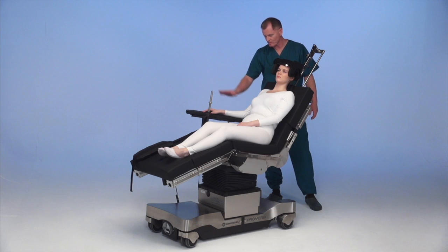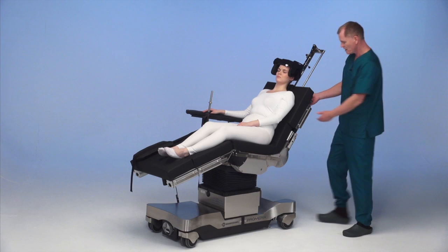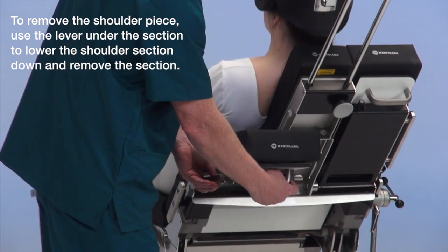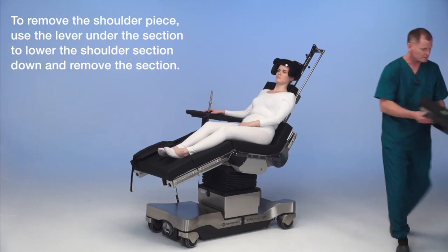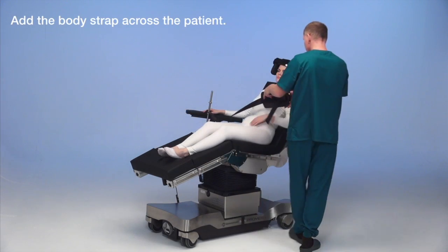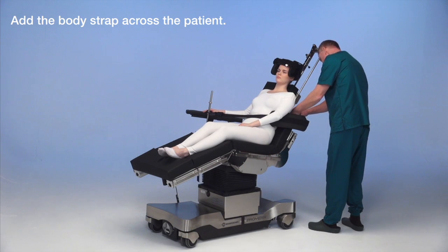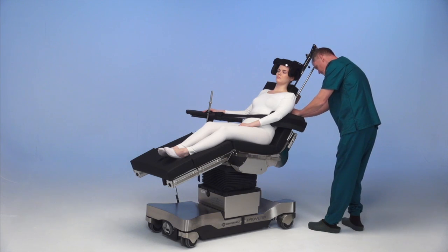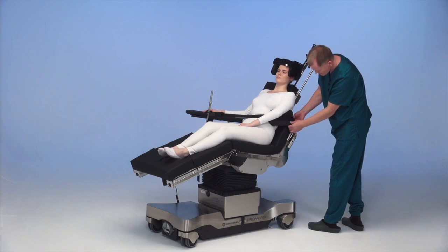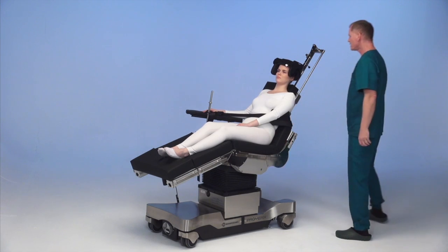We've got her ready to remove the shoulder plate and strap her in. There's a planing arm board on the other side of the table that adjusts for her in the seating position. A little lever underneath the handle lowers it down and removes that section. Then the body strap goes across the patient, and we've got her strapped in pretty well with good mobility on the shoulder.